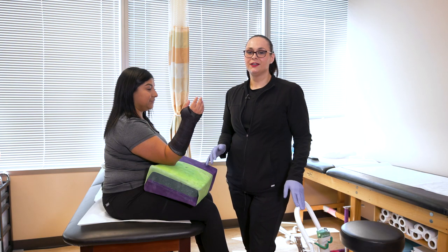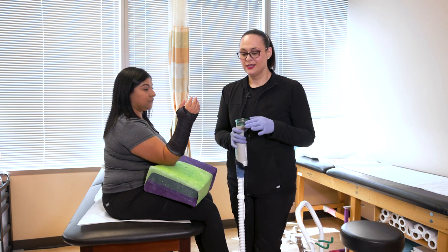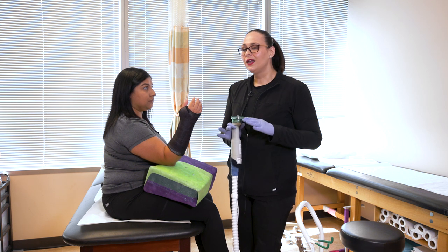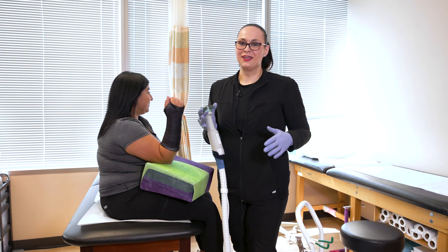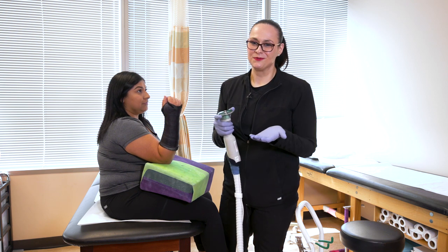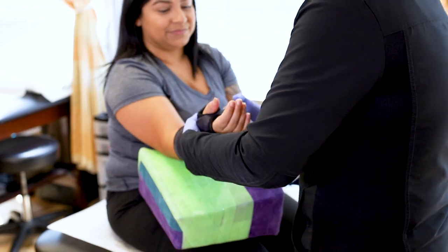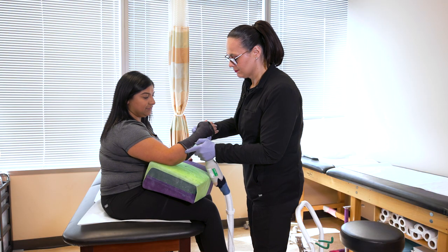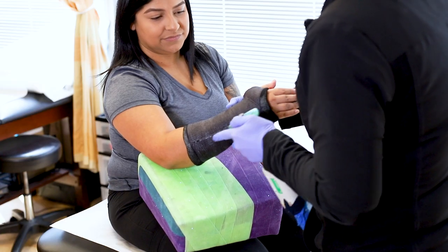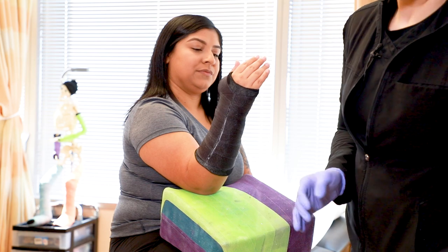During your follow-up visit when you come back to have your cast removed, we use a cast saw. This saw works through pure oscillation — the blade doesn't rotate, it just vibrates. It makes a lot of noise but all you're going to feel is vibration and maybe just a little bit of heat. Before I remove the cast I like to show patients that it's completely safe by giving it a few taps on my hand. Now that it's cut, we're ready to crack it open with the cast spreaders.